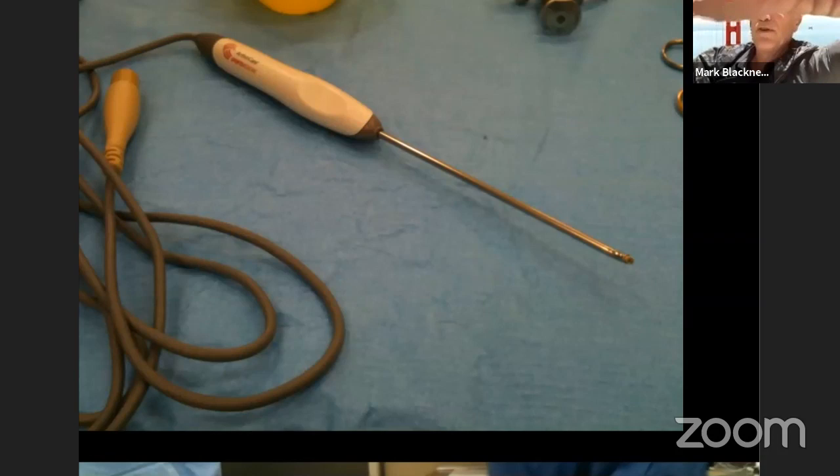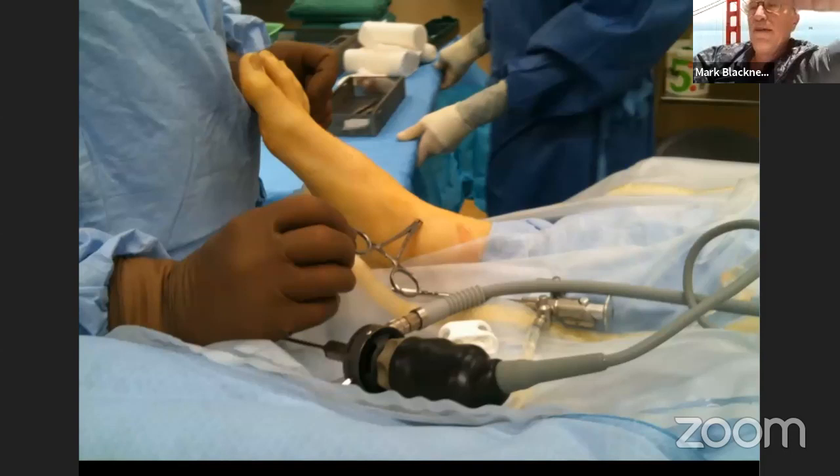So in here we have insertion of the first portal, which you saw before. Medial portal is entered first. You can inject saline or not, depending on how comfortable you feel. And this will assist you with locating your lateral portal. Usually I will put the arthroscope in here, which allows you to visualize the lateral side quite well. You can visualize the nerves, any vessels, and then I'll make a lateral portal after that.